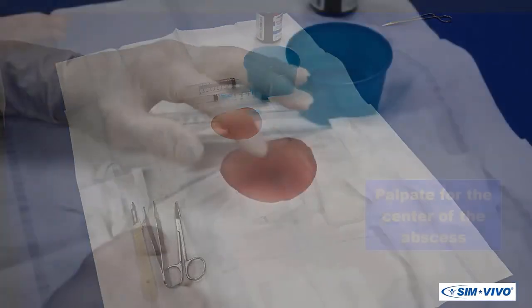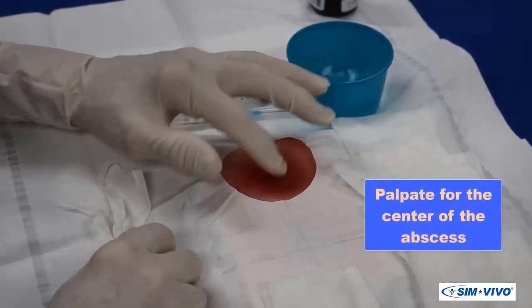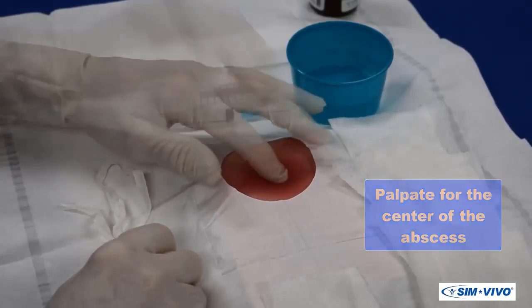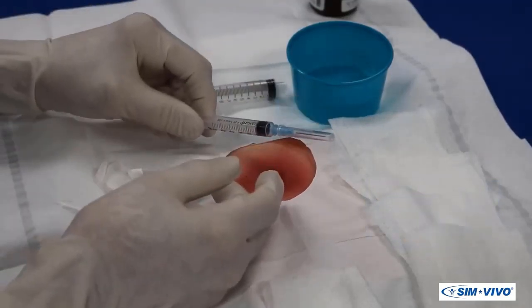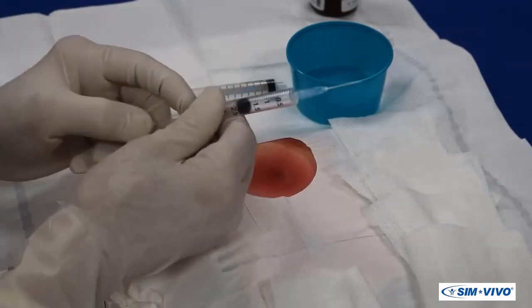You can palpate the abscess before starting. Usually there is a soft spot at the point where the abscess is migrating to the surface. The use of local anesthesia is a bit controversial, since lidocaine is relatively ineffective in infections.